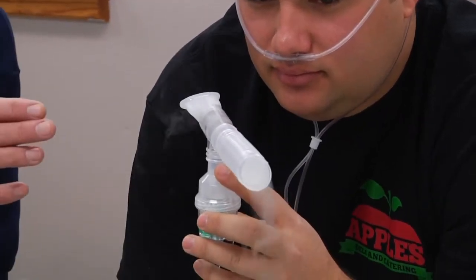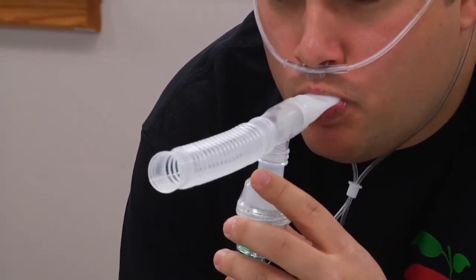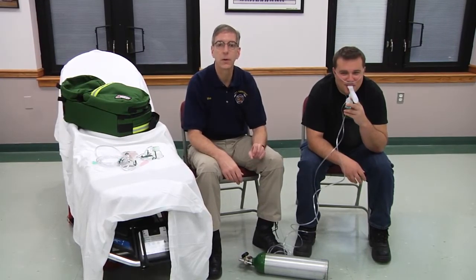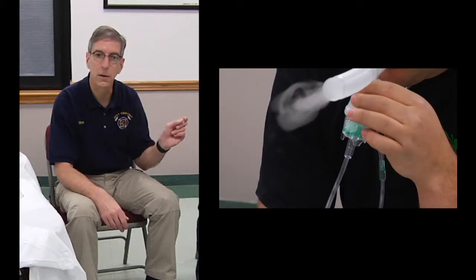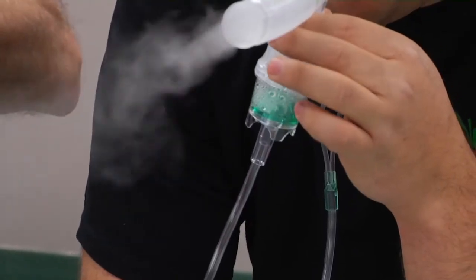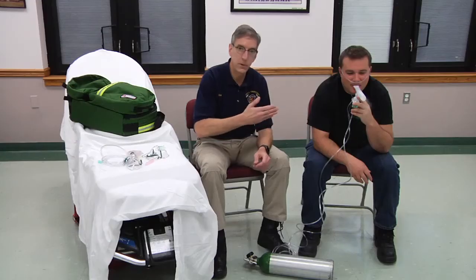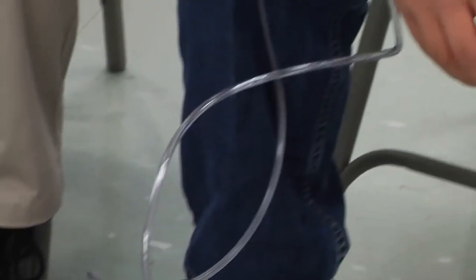You can see now the nebulizer is distributing the medication. The faster the flow rate through the nebulizer — in other words, the higher you turn the liters per minute on your oxygen cylinder — the smaller the particles will be that the patient's inhaling. If you want to deliver particles deep into the lungs, you need a flow rate greater than 5 liters per minute. If you get this up to 10 liters per minute, you get even smaller particles and better deposition into the lungs. Less than 5 liters per minute delivers particles that are only going to go into the upper airways.